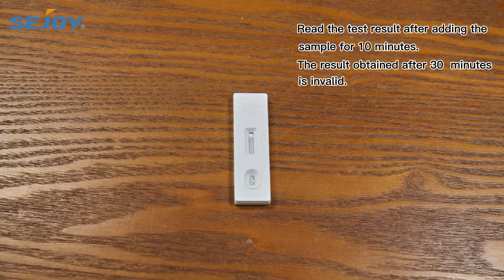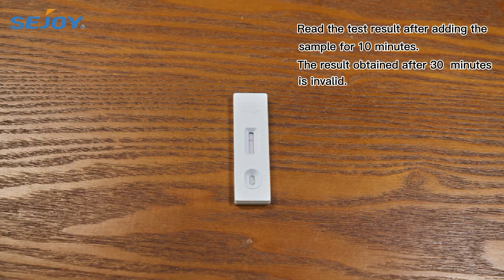Read the test result after adding the sample for 10 minutes. Any result obtained after 30 minutes is invalid.